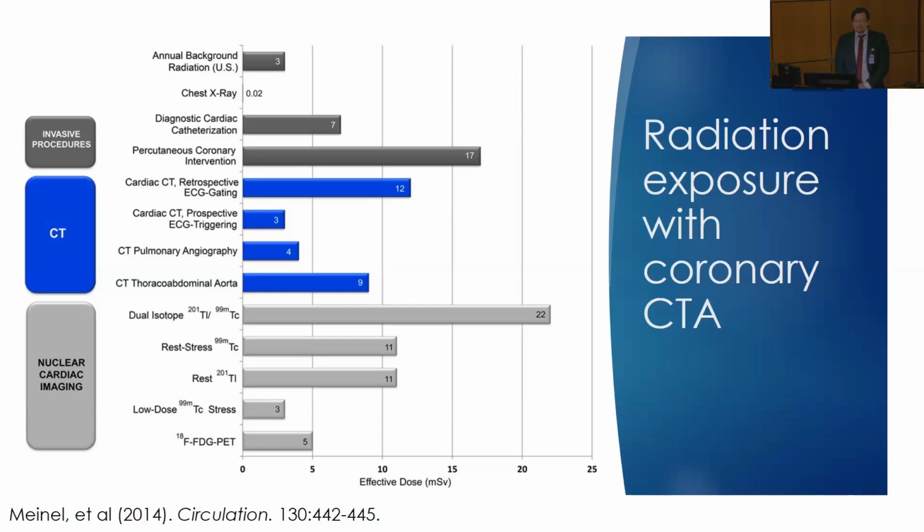Cardiac CT depends on what protocol you're doing. If you're doing prospective ECG triggering, this just means that the machine is brilliant enough to capture just one small phase between each heartbeat. So it's not scanning the entire 1 second between each heartbeat. That helps reduce the radiation.